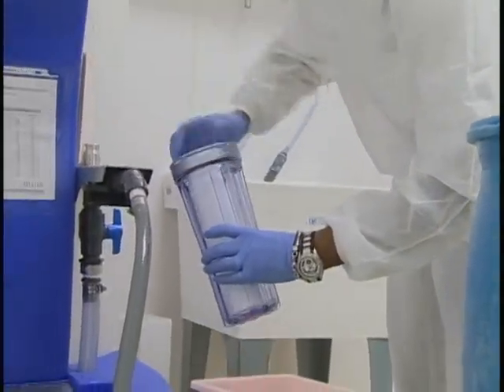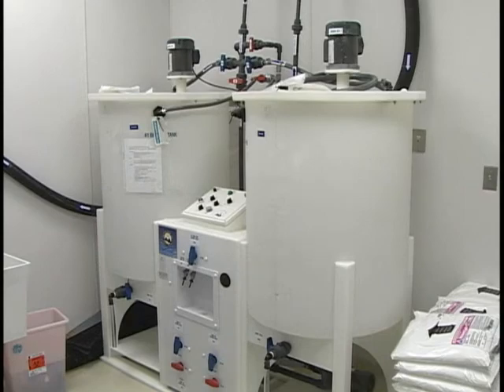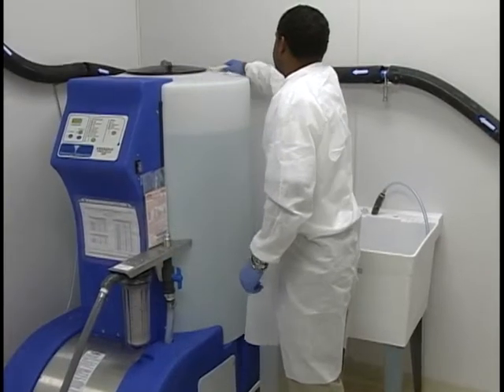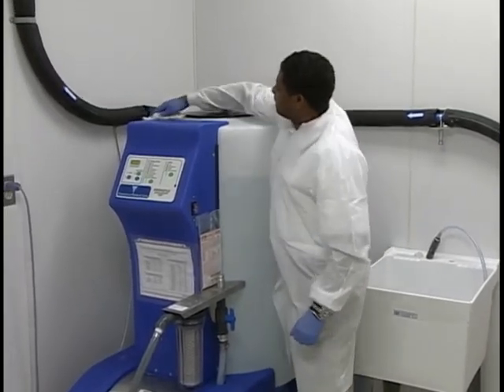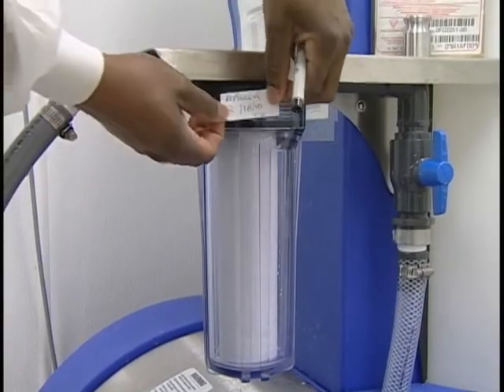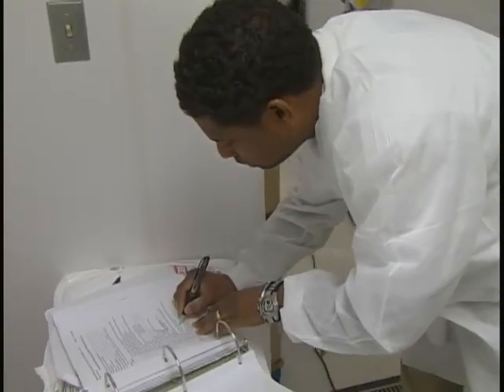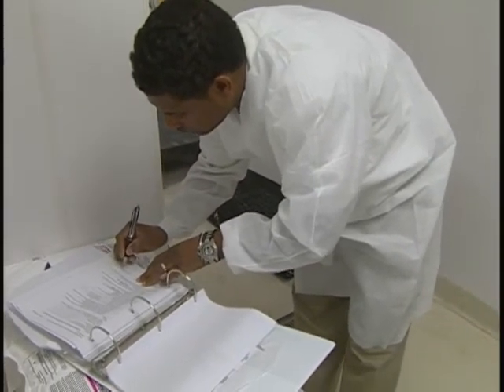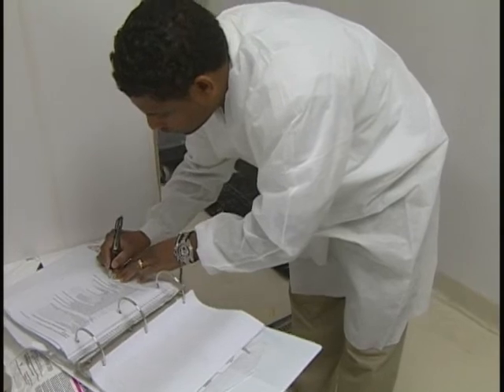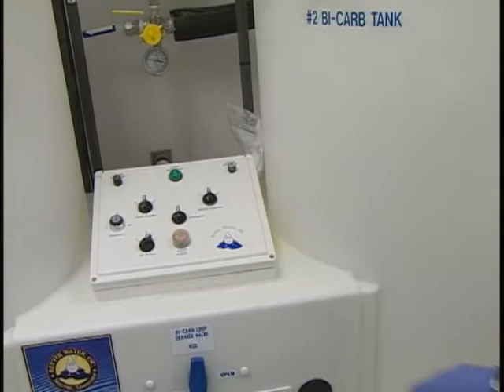Your environmental tour and observations of the dialysate mixing area should also confirm that dialysate storage containers, as well as mixing equipment and delivery system, are functioning properly, cleaned regularly, and operated in accordance with the manufacturer's recommendations. Reviewing the maintenance logs and verifying the preparation instructions and expiration dates on chemical supply labels can confirm that the facility is following manufacturer's instructions and is compliant with regulatory requirements.